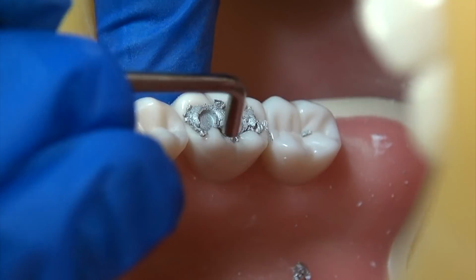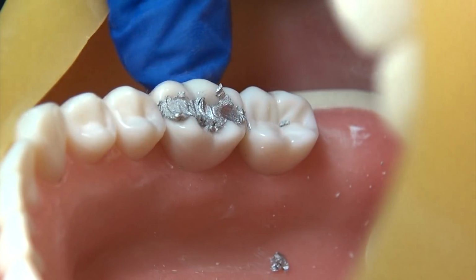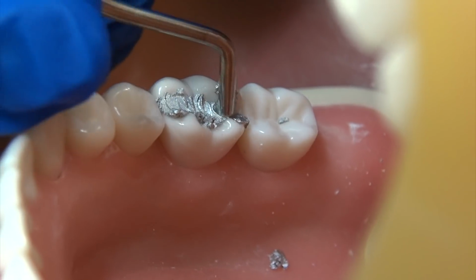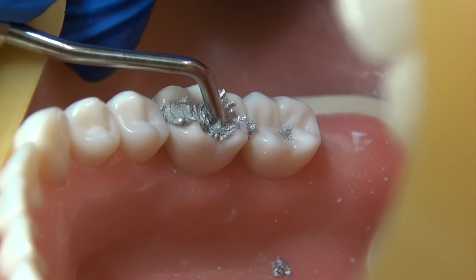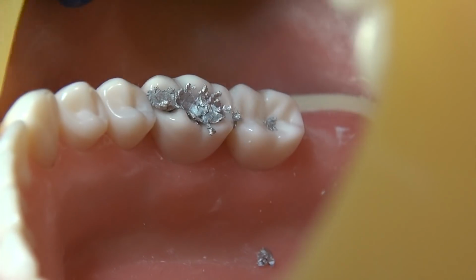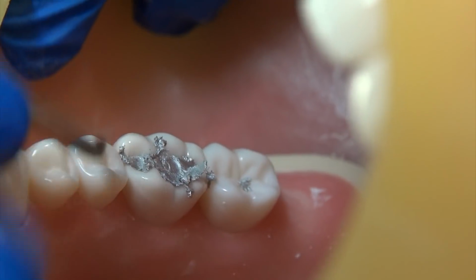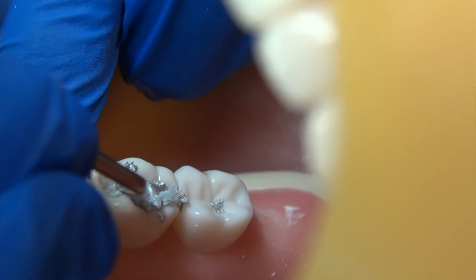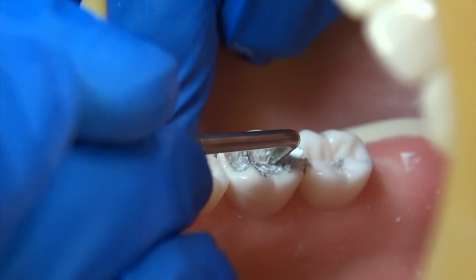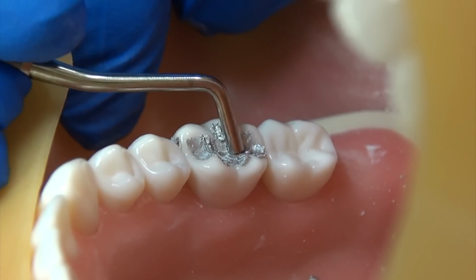Now for this last one, we want to make sure that we're overpacking it. So condensed. As you notice, once you get to that final layer, you're going to have a really shiny look. Now that's as it's becoming more and more condensed. Now here you can really focus on doing that lateral condensation, and it almost starts to create that form. Now as you come back and you're doing that walking, you're walking laterally. Might want to practice with your stress ball leading up to the exam. Get those hand muscles working.